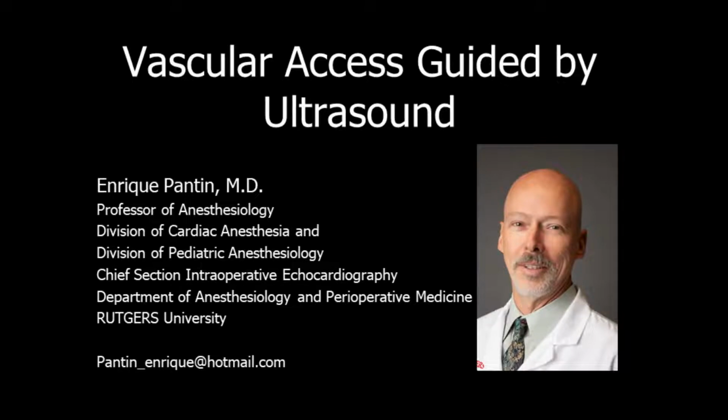Vascular access guided by ultrasound. Ultrasonography has changed the way we practice medicine, especially in acute care and anesthesiology.